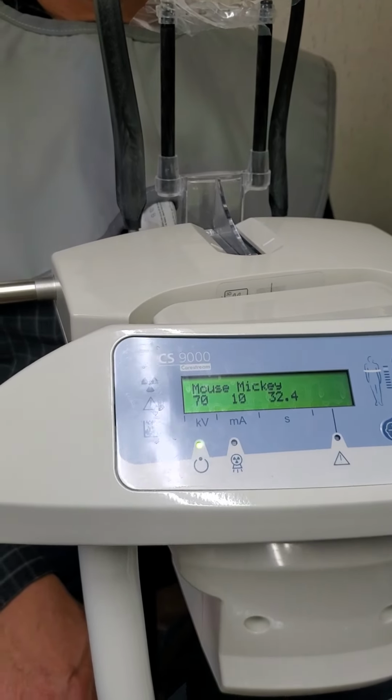Sure. So if we want just from the root tips to include the root tips and the full crown, leaving about 4 lines, just a few showing for a top tooth. That's the setting you want.